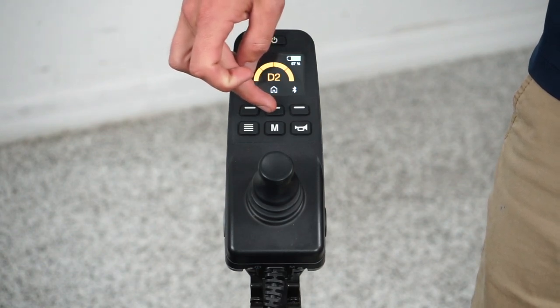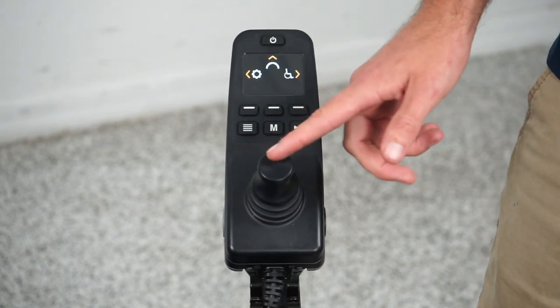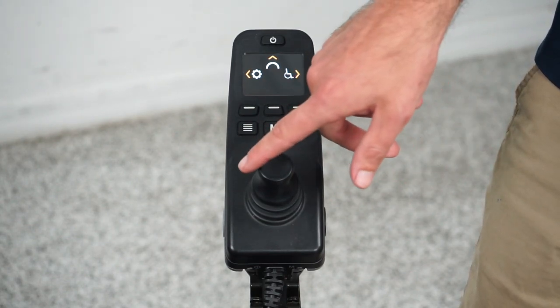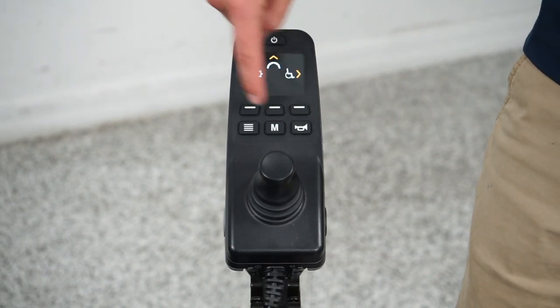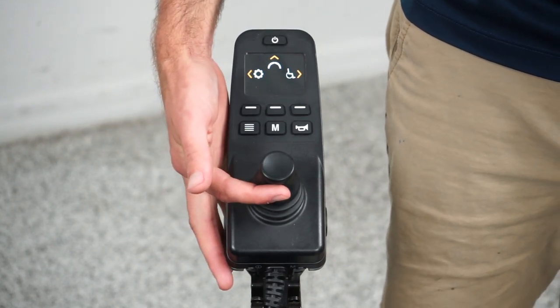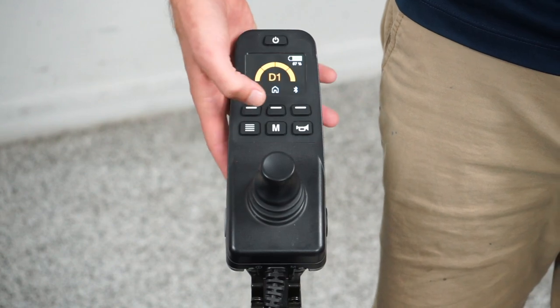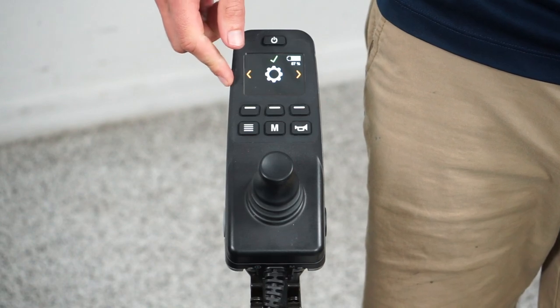I'm going to press the home button. From here I can use the joystick to navigate. If I go to the right, it'll go to the function menu. If I press the home button again, we're back where we just were. If I go up, we're back to the drive. And if I press the home button again and go to the left, we're in the setting menu.